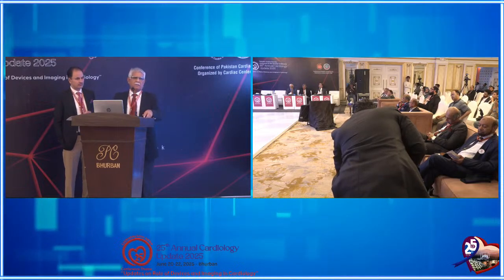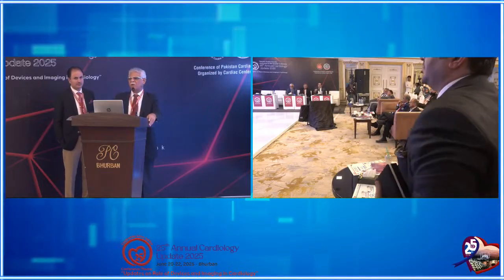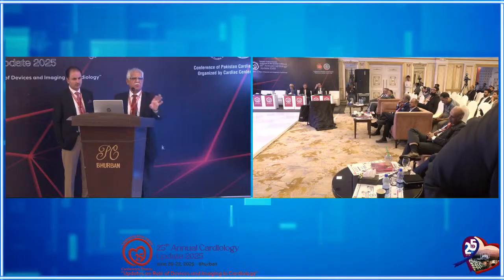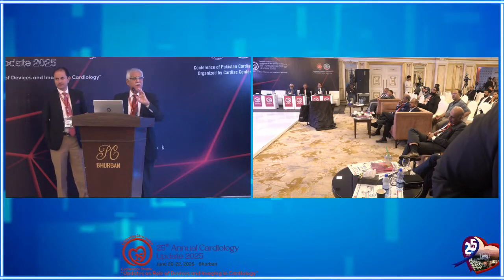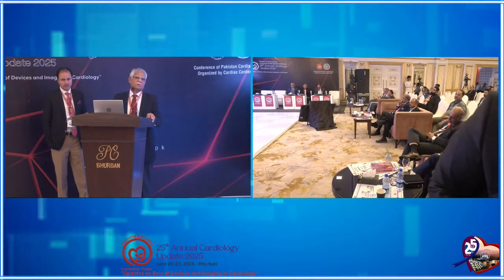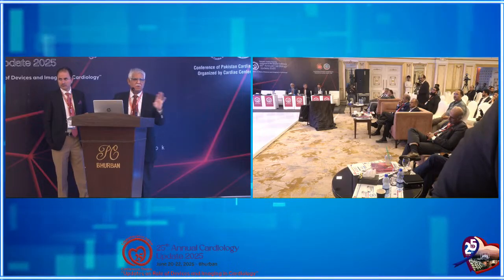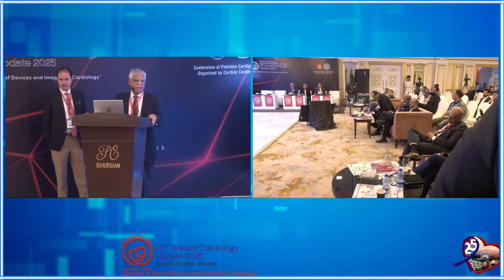If the calcium score was 0, soft plaques can still be there. This morning, I showed one case in which the patient was symptomatic and the calcium score was 0. But when we did CTA, the left main stem was 100% occluded and the patient had tight stenosis in the RCA as well. So calcium score is of no value in symptomatic people.